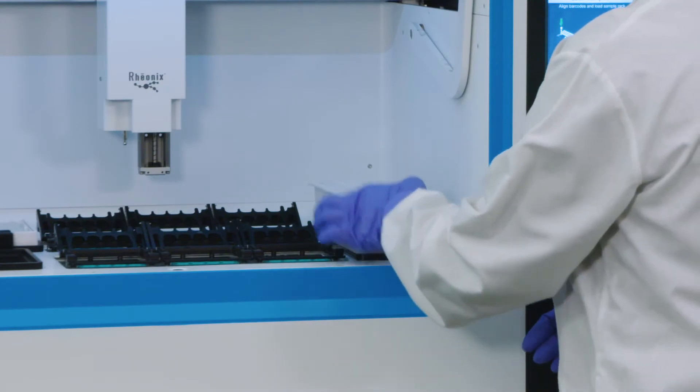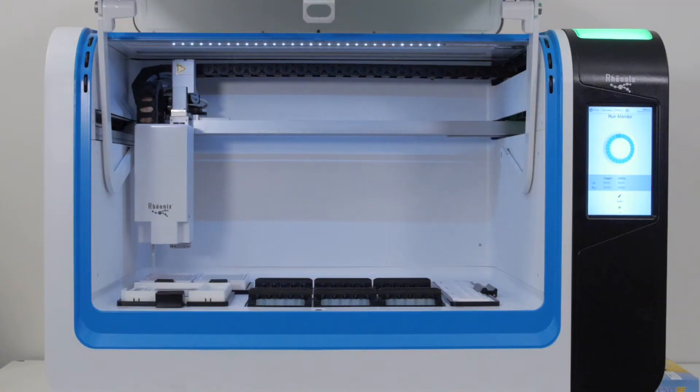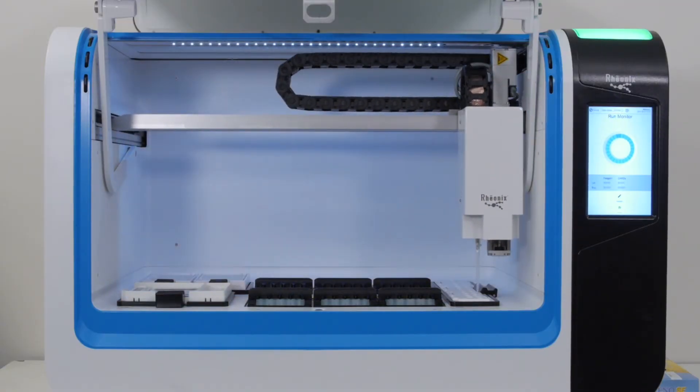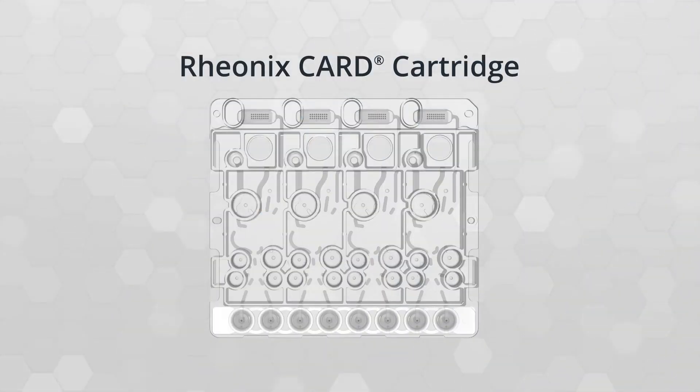Simply place your samples on the workstation, and the Encompass Optimum will take care of everything else. The workstation uses robotic liquid handling, pneumatic signaling, and magnetic bead isolation of DNA to run assays on its microfluidic cartridges.